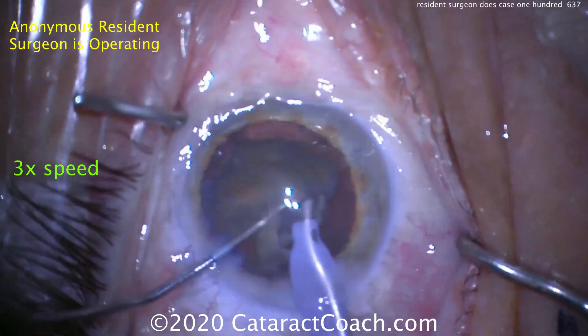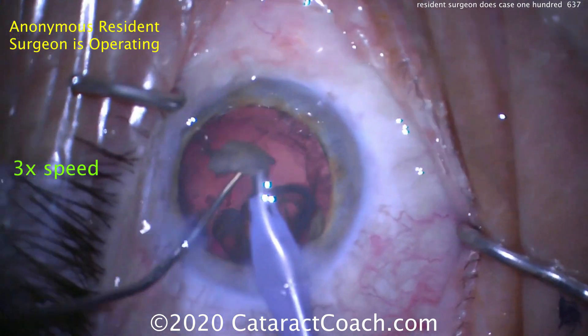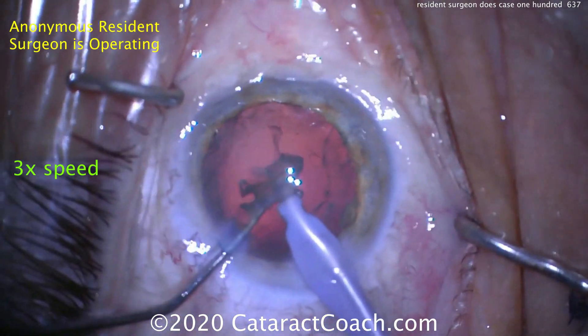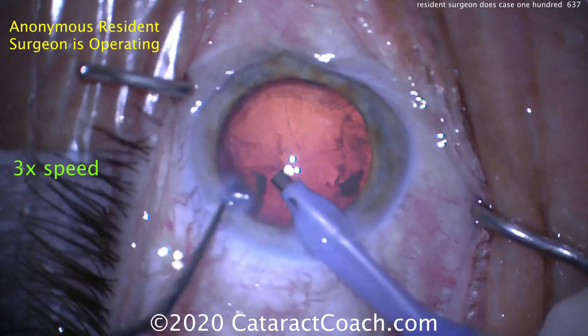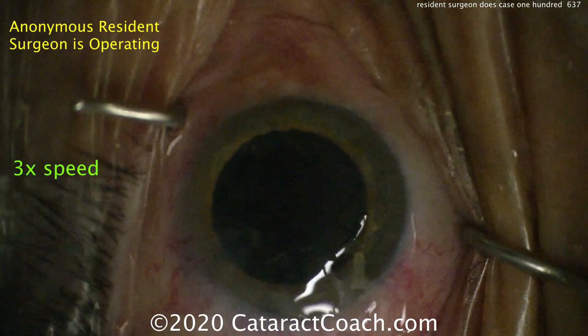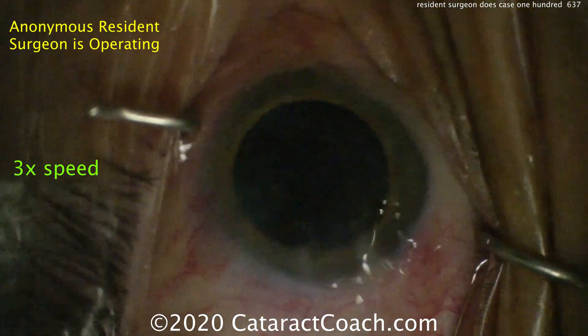That's a nice way of transitioning into learning phaco chop. The next move for this resident would be to switch to doing all cases with the stop and chop technique. And once that's really mastered, then switching over to doing just a direct chop or a quick chop technique. But that looks great — removing all the rest of these little nuclear bits. There are a couple of little pieces left there; you can get those out with the phaco probe or the IA probe.